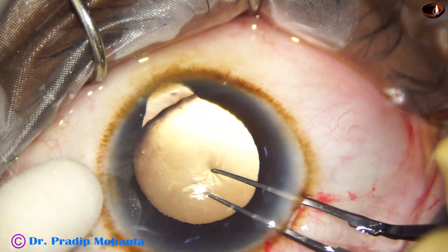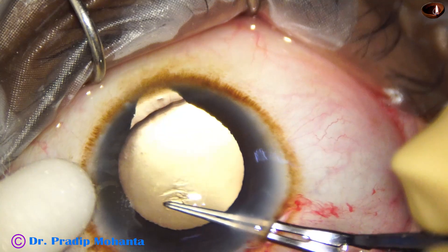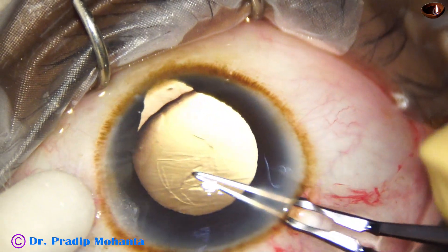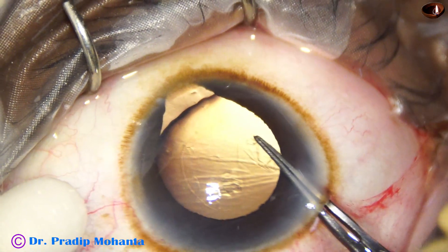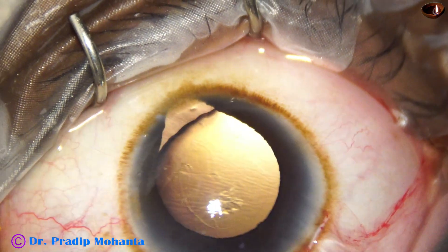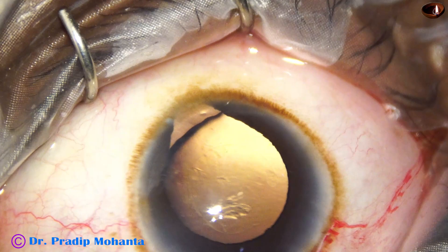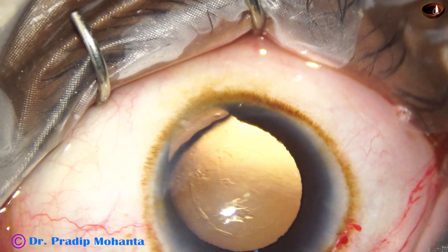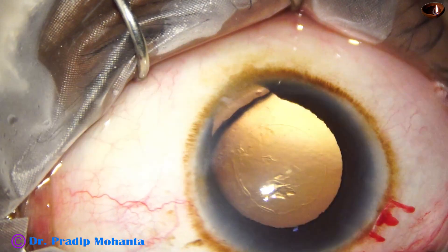I am trying to hold the capsular tag — it is becoming difficult. I could hold the tag and had to go clockwise. I have to be very careful at this time, and the size of the rhexis should not be more than 4.75 mm — and it is that. The size of the rhexis is about 4.75 mm, because if it goes to the periphery, it will not be able to hold the capsular tension ring.